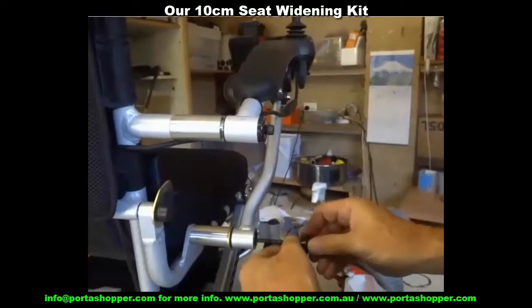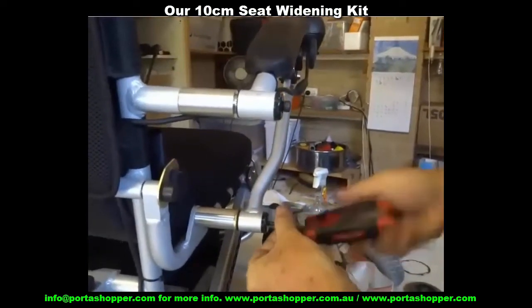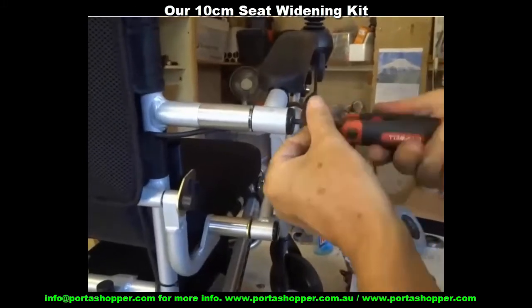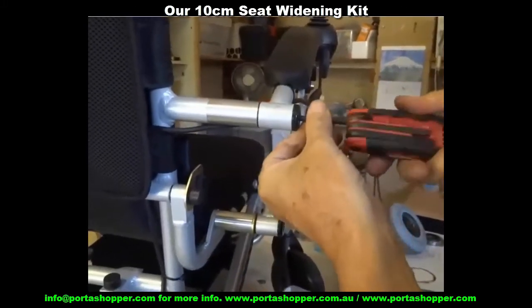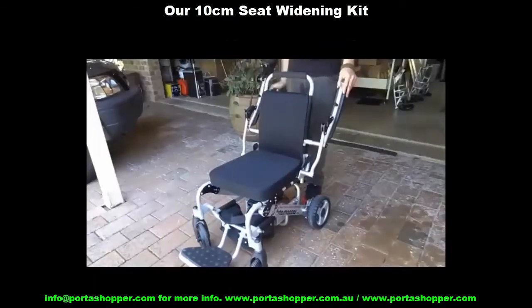And if you're a little wide in the hips and you doubt you'd be comfortable in that chair, have you found another model that comes with an expansion kit for easy widening of the distance between the armrests by a further 10 centimeters to a total of 55 centimeters?